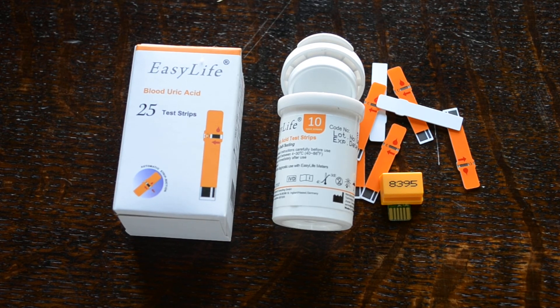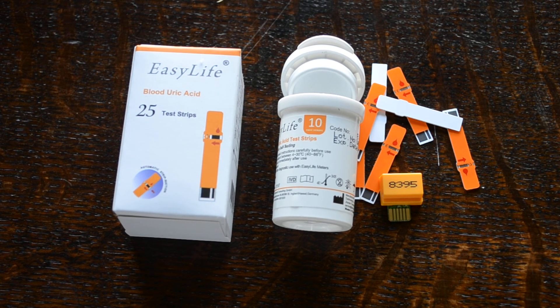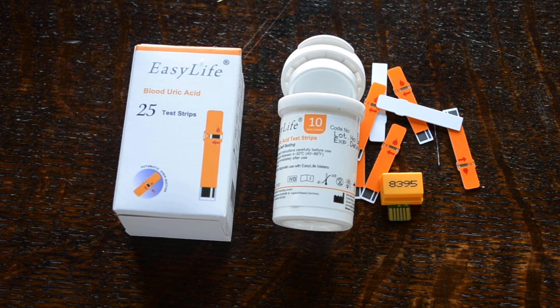It is important that when you start a new pack of strips, you insert the correct and matching code chip into the reverse of the meter to ensure the accuracy of the test results. That is what you get when you buy the 25 EZLife blood uric acid test strip refill packs. These are available online and also from Valiumed.co.uk.